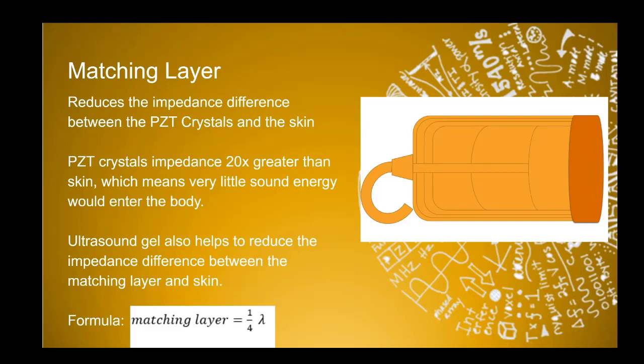The matching layer then is going to be a calculated thickness, and the thickness of the matching layer has to do with the frequency of the transducer, because we know that frequency affects the wavelength. So the matching layer is 1/4 the wavelength of the frequency of the transducer.